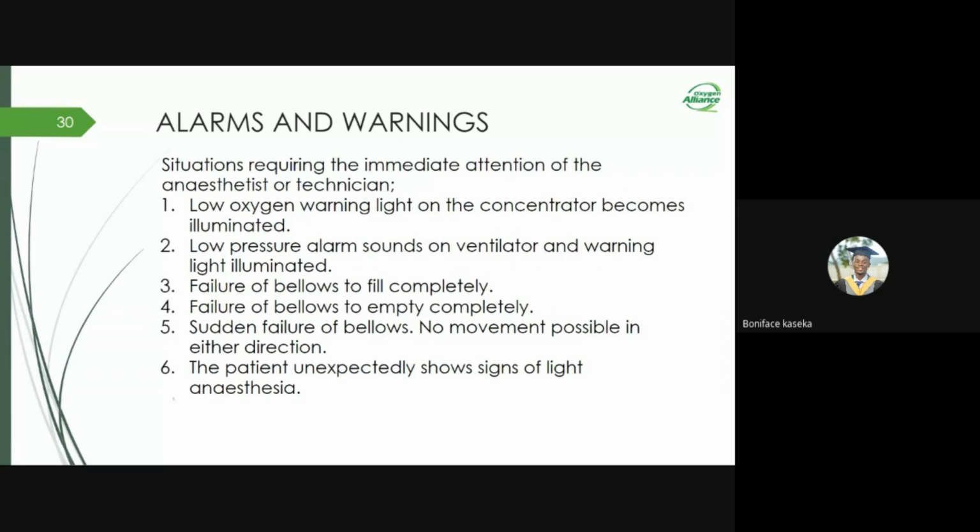Going ahead, we can also have a low pressure alarm sounding on the ventilator and the warning light also illuminated. This is many times caused by leakages or complete disconnection of the anesthetic tubings.